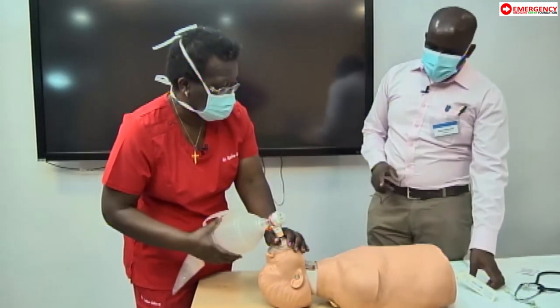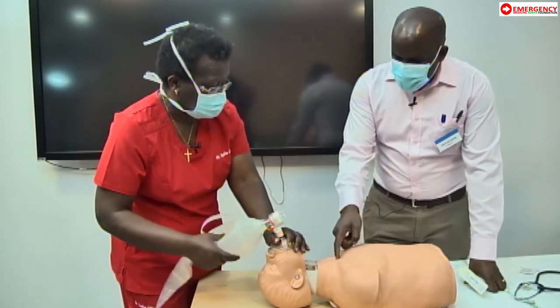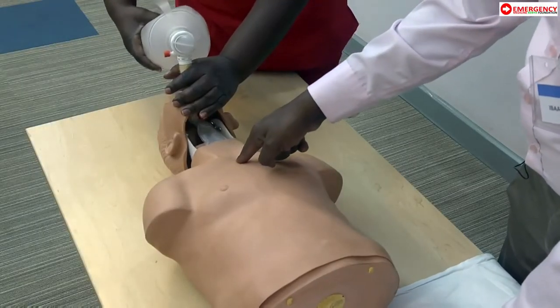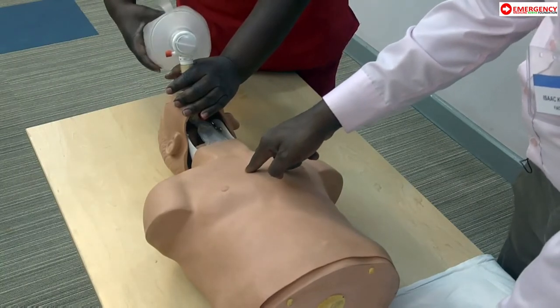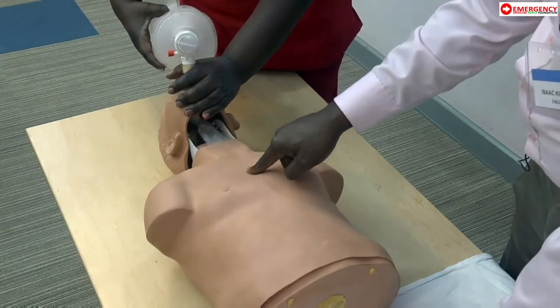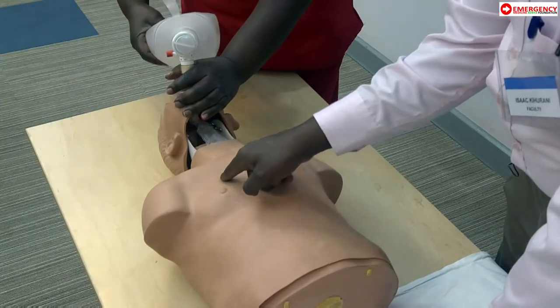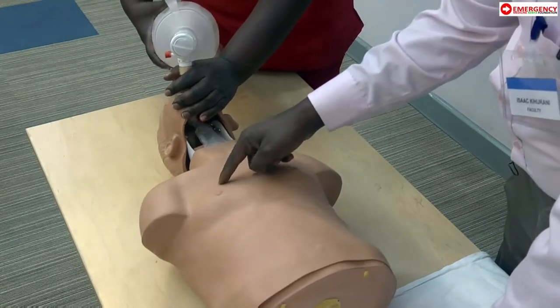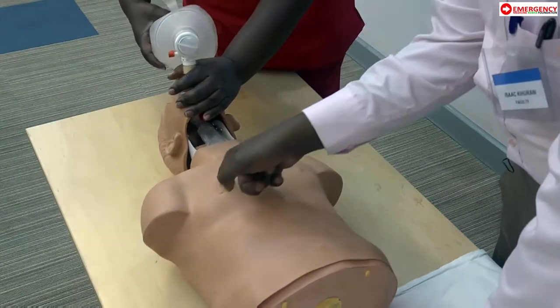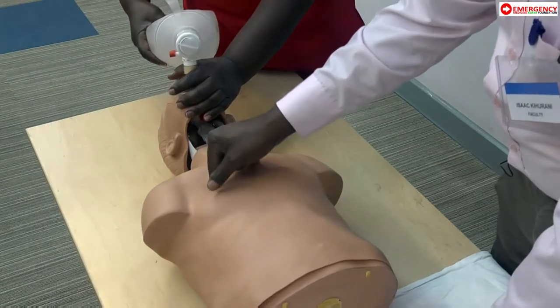So what are you supposed to do in those circumstances? As an immediate emergency, identify your sternal notch, which you can feel there, then palpate down the sternum and feel for the sternomanubrial junction. Once you can feel it, move to the side with the tension pneumothorax, and you will feel a space. That's the second intercostal space. Go all the way to where the mid-clavicular line is likely to be, maybe just around the area of the nipple.